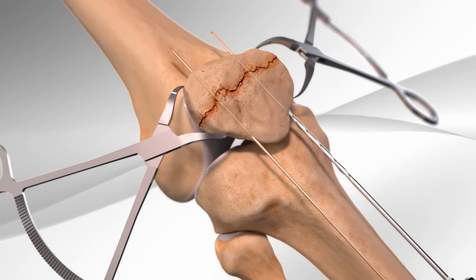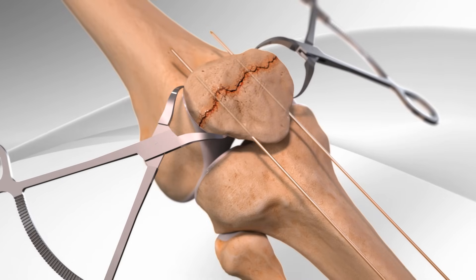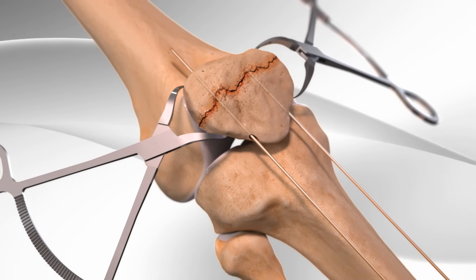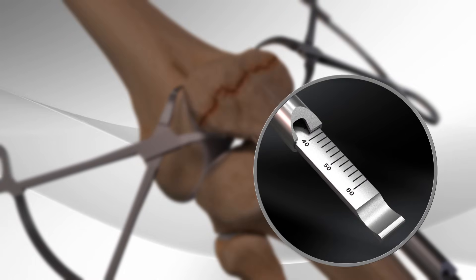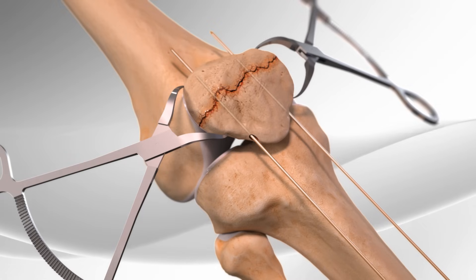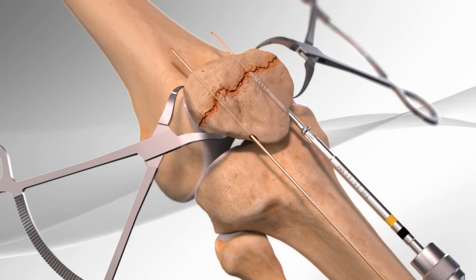The surgeon then drills through the bones where the wires are placed. The drilled holes are measured to determine screw length, then the correct screws are placed into the drilled holes.